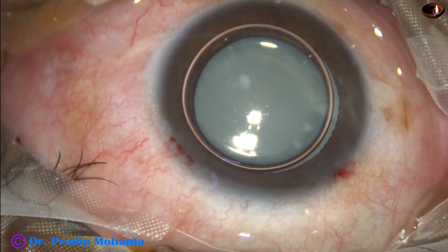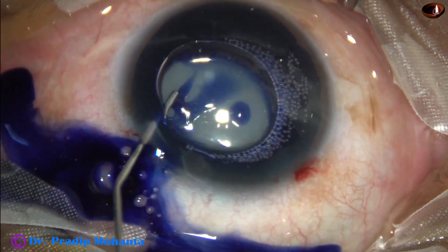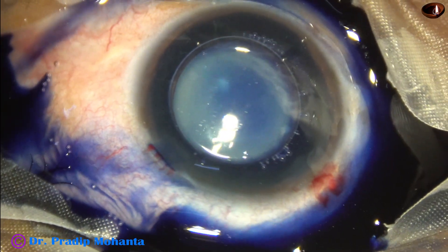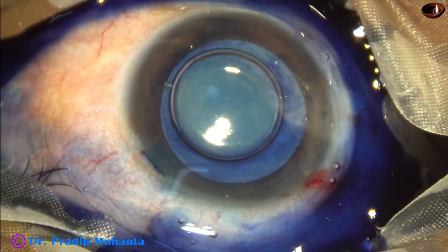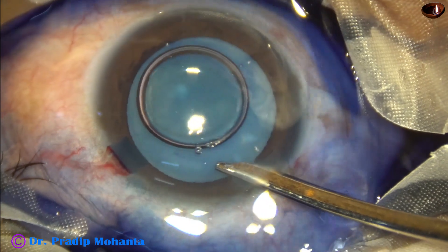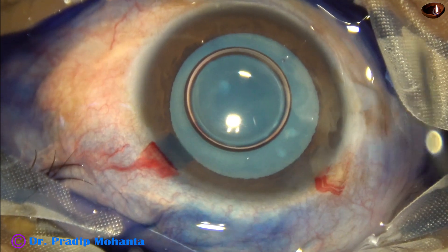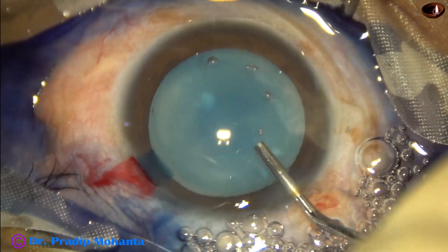Now the anterior capsule is stained underneath an air bubble with trypan blue dye. The dye should touch all parts of the anterior capsule. This is a bit of adrenaline, and now the dye is washed out. There is nice staining of the anterior capsule in a short time because the dye was injected underneath an air bubble.